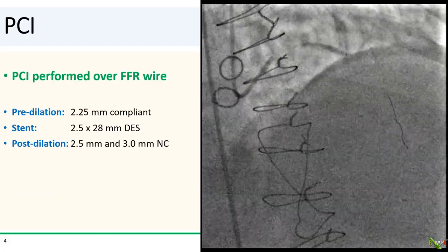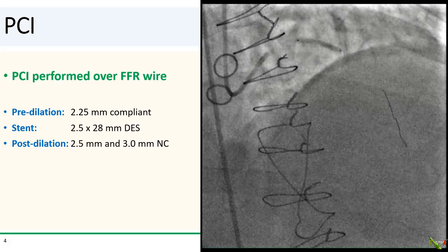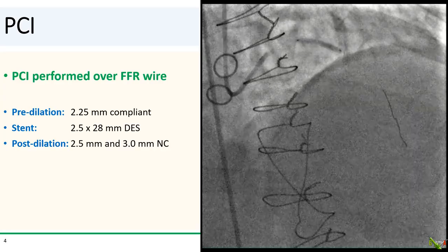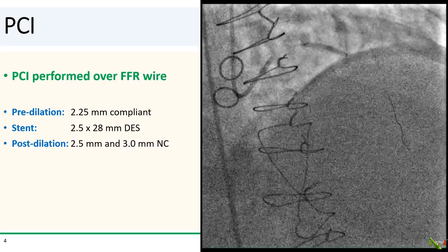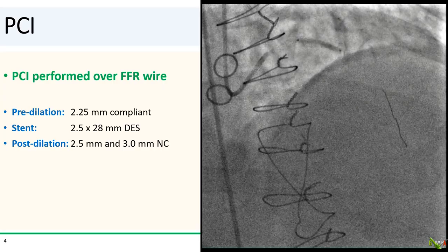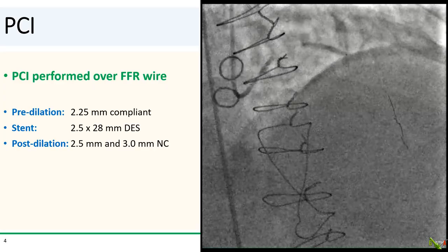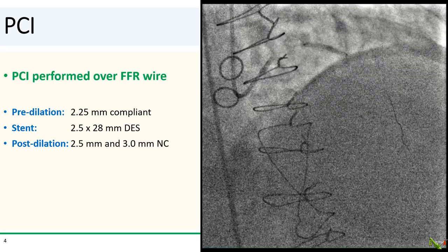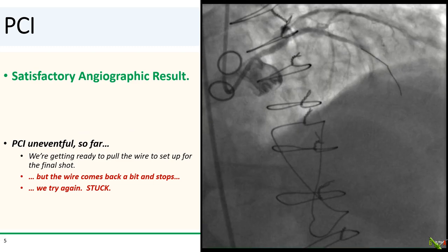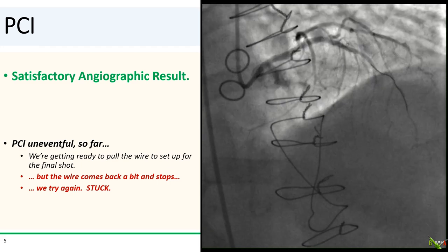Because we had a tough time wiring the LAD, we decided to perform PCI over the FFR wire. Thankfully, our equipment passed without much of an issue. We pre-dilated the LAD with a 2.25 mm balloon, stented with a 2.5 by 28 mm DES, and sequentially post-dilated with 2.5 and 3.0 mm NC balloons, achieving a fairly nice angiographic result.